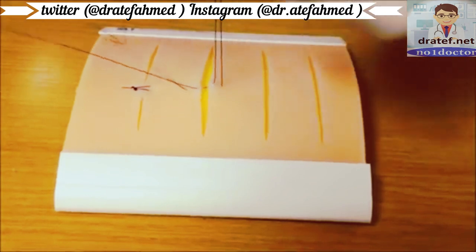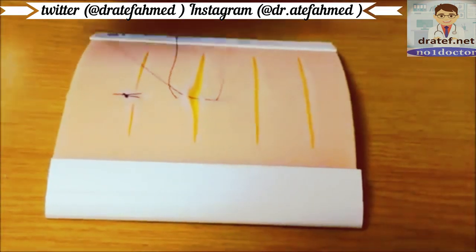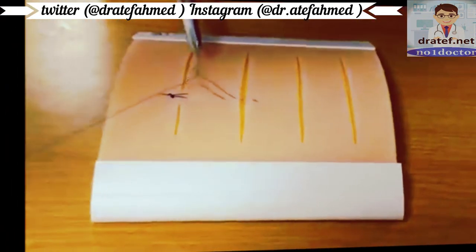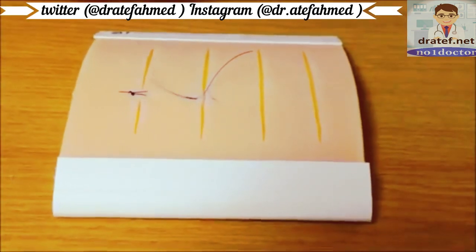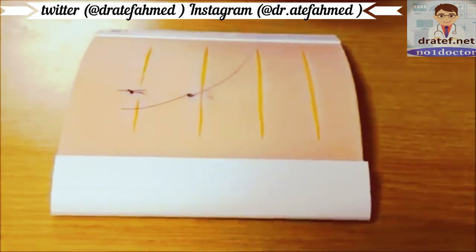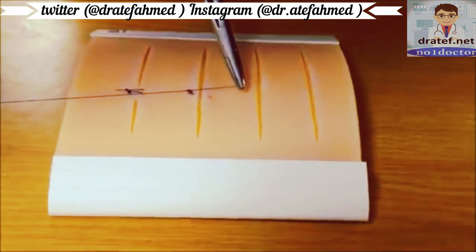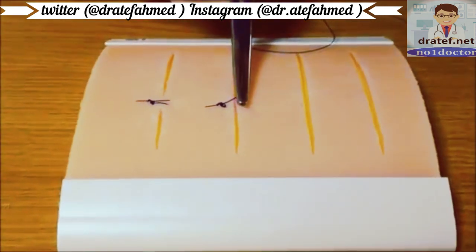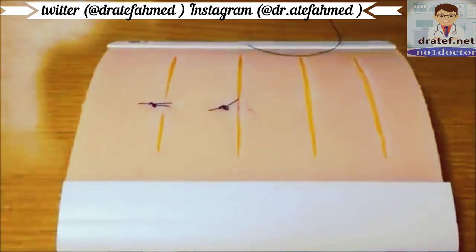Pull the suture material through until you have just enough to tie the knot. You will notice that the suture lies to the side of the wound with no material crossing it, and that it results in slight eversion of the wound edges, which may promote healing.